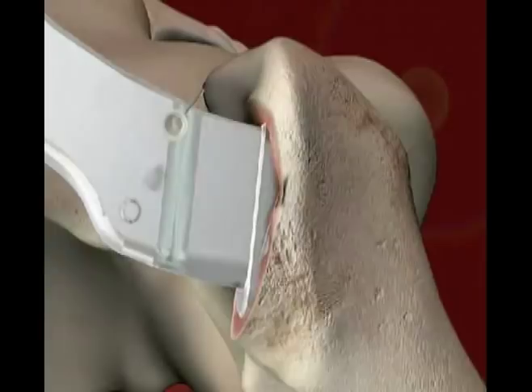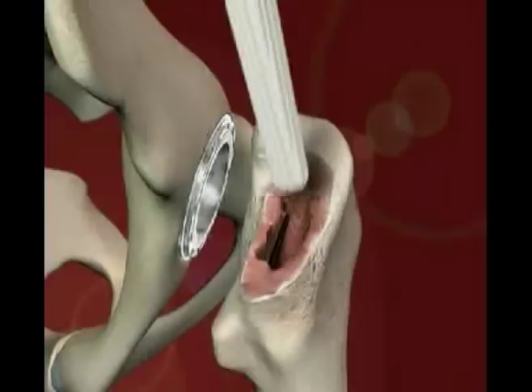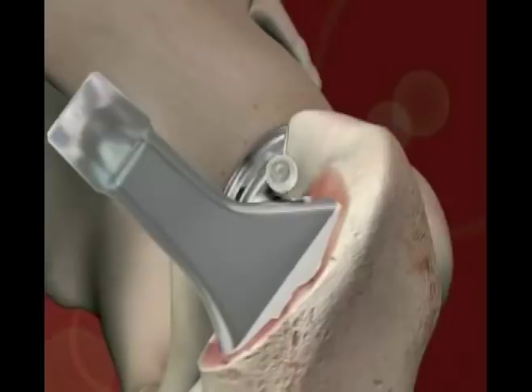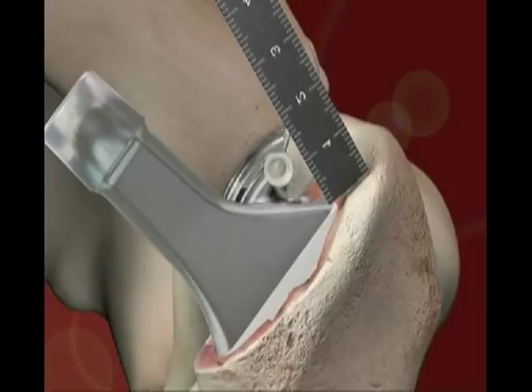The definitive stem is the same size as the last broach used. The implant is introduced and impacted into the canal using the femoral component impactor and aligned in the central axis of the femur to the level of the HA coating. Place the appropriate femoral head onto the taper, reduce the hip, and perform a final stability check.